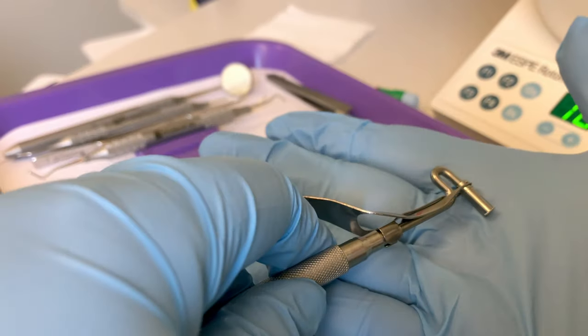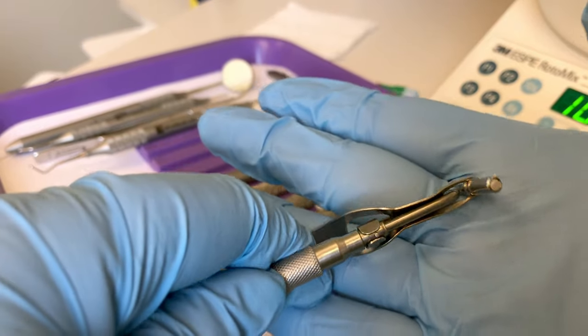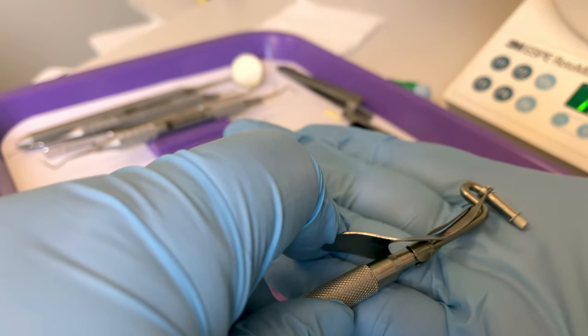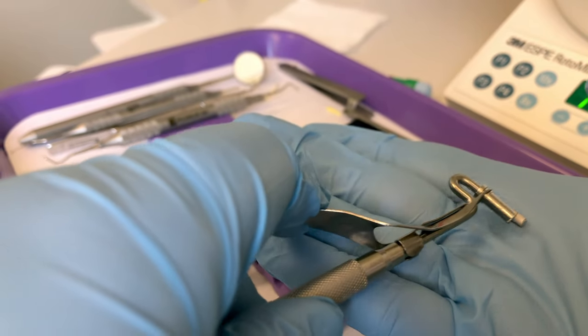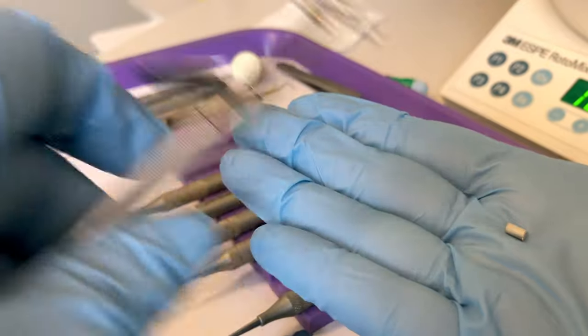Before I do that, I want to show you what these look like. We pack the amalgam into the carrier so when the doctor dispenses it into the preparation, they get a nice solid cylinder of amalgam that they can then pack into the preparation.